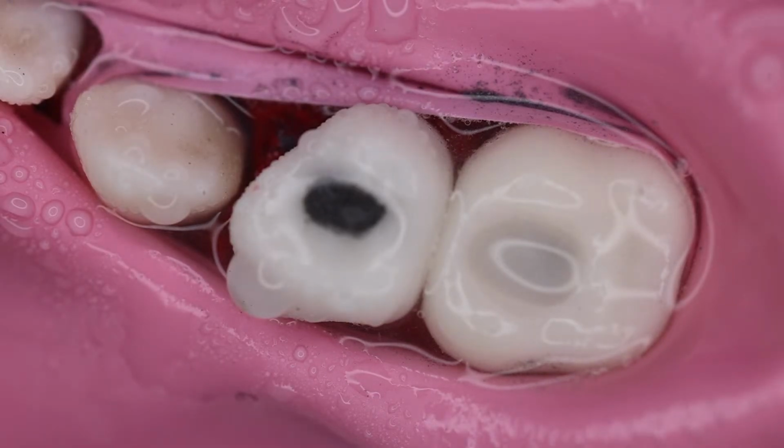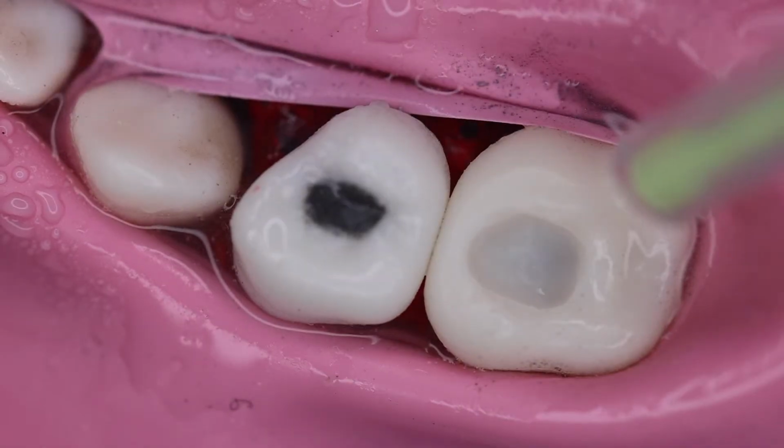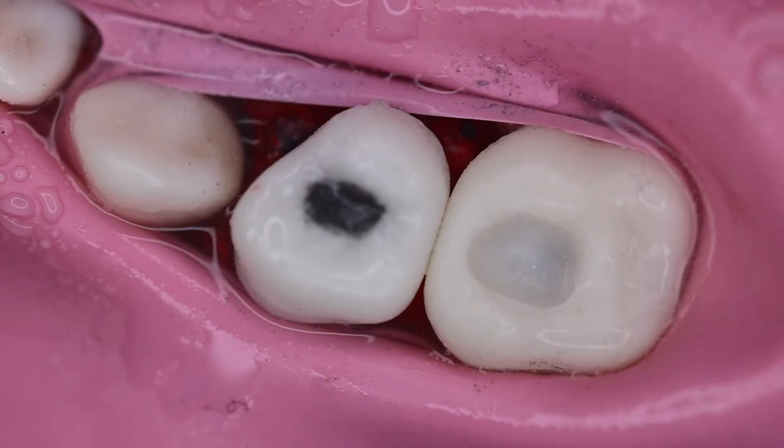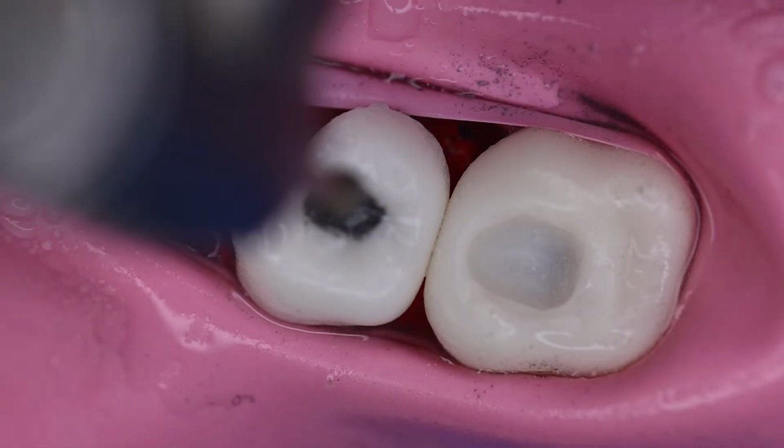Over here we are able to remove the caries in this primary molar. This is tooth number 5. You can appreciate that the caries has been removed. Now let us progress to the other tooth.